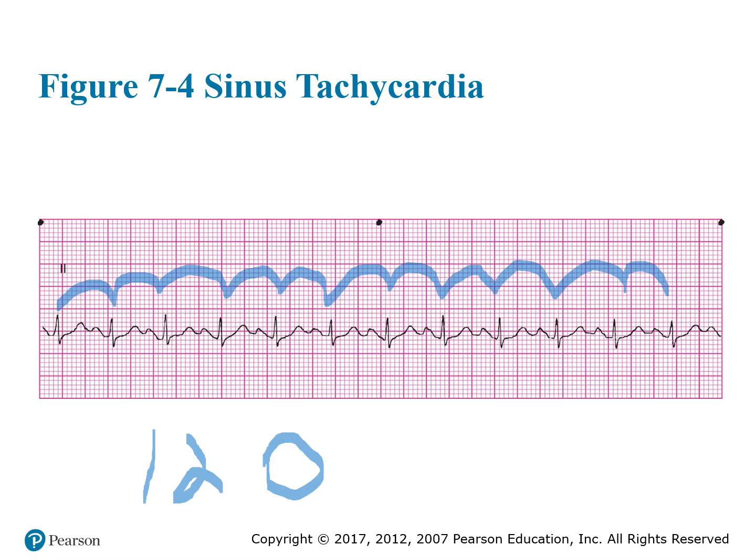We do have a P for every QRS. The P's and the T's look very similar here, especially this one right here, the P wave and T wave look very similar there. Be aware though that they're not the same, right? So this is a P wave, this is your QRS right here, and then this is your T wave that follows it. If you have a QRS followed by a little hump, more than likely that's going to be a T wave, right? So don't misinterpret these T waves and call them P waves, right?